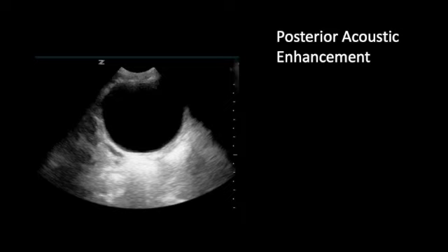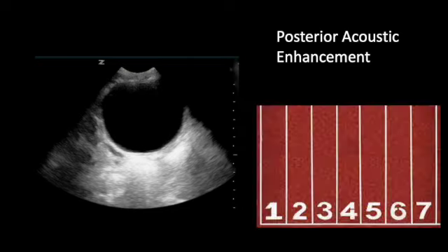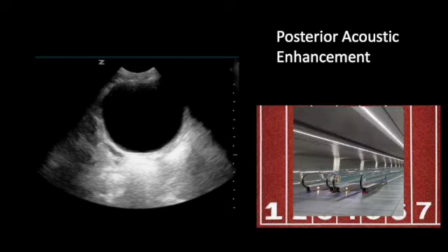So the analogy that I like to use for this is, imagine that you're running a race and you have a track lined up and there's lots of different lanes, but some of those lanes have those moving platforms like you see at the airport. So you can imagine that if it was a lot easier for you to get to the other end of the airport terminal by walking on one of these, the same thing can happen with the energy in the ultrasound ray. So if it takes less energy for you to get to your terminal, you've got more energy to come back and get a pretzel before you get on your flight, those kinds of things. It permits higher throughput of wave intensity and thus causes the images to appear brighter in the far field.